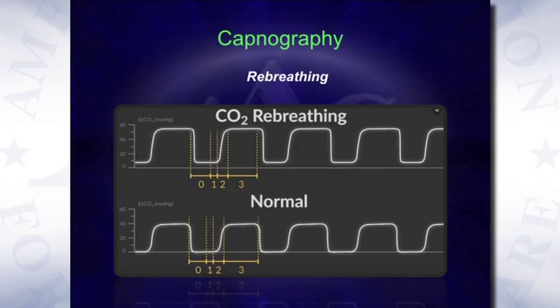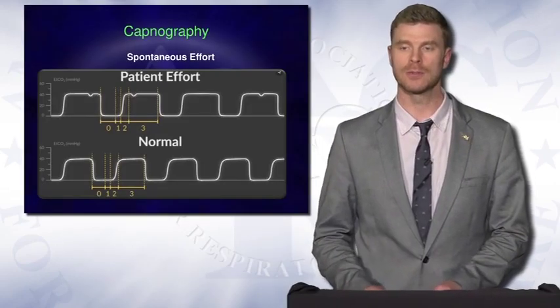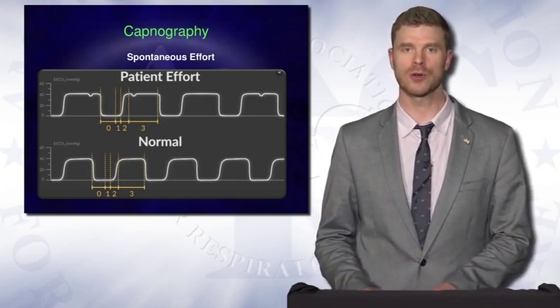Here you can see that there's no increase or decrease in the level between breaths, but what you may see in clinic is a slow rise or a staircase as CO2 builds up in the system. That is, every time the patient exhales and tries to breathe in, there's even a little bit more CO2 in that system. This is perhaps one of the most important ones to recognize at the bedside, but also one of the most difficult to correctly assess.